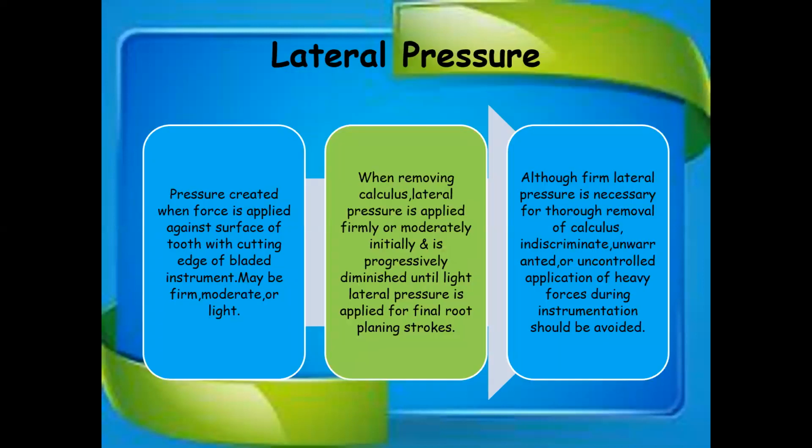Coming on to lateral pressure. What is lateral pressure? It is the pressure that is created when force is applied against the surface of the tooth with the cutting edge of the bladed instrument. It may be firm, moderate or light.